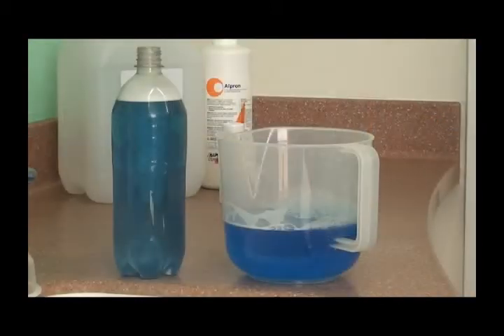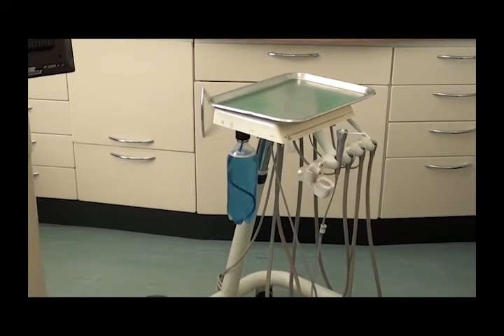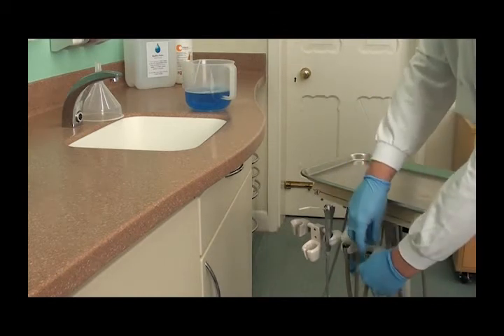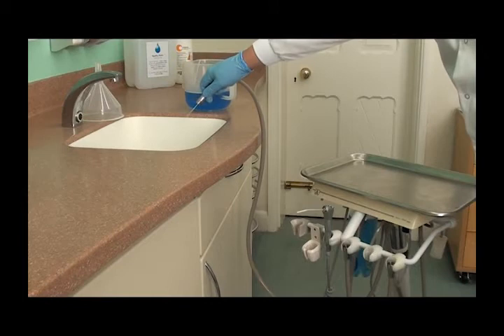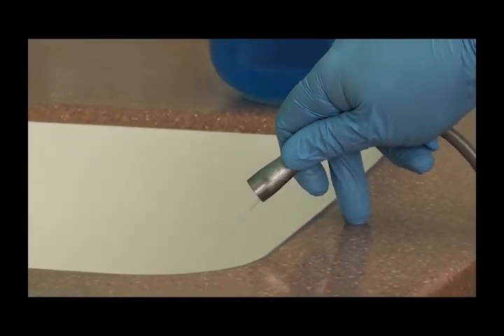Pour this solution into the bottle and reattach to the unit. Repressurize and purge through each outlet until the pale blue colour can be seen coming through. At this point, stop and, like before, leave in the lines for at least 20 minutes.